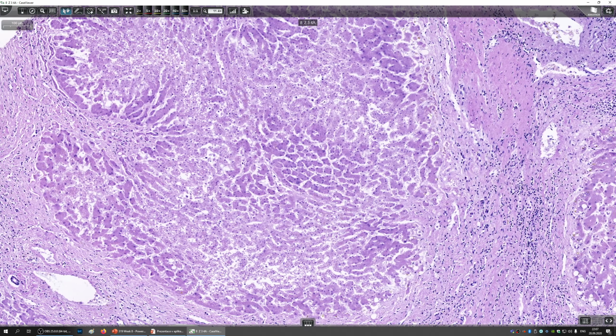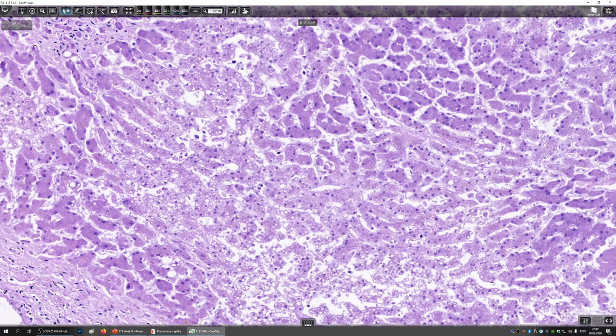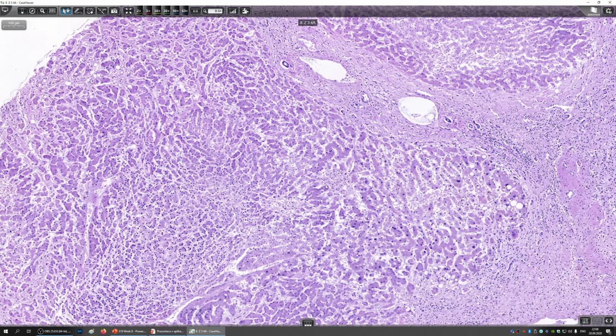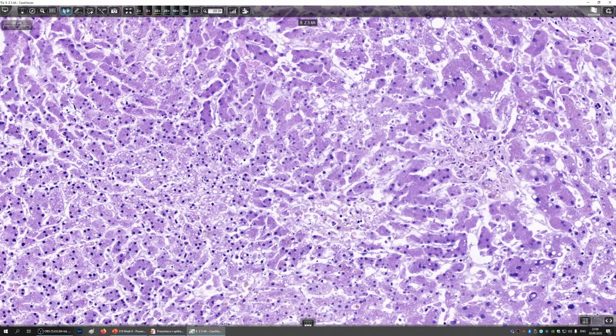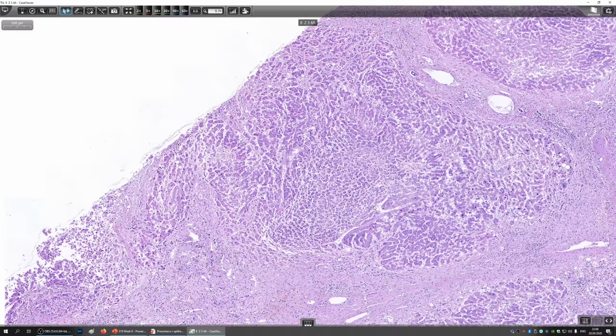So this person had cirrhosis, but we can also see signs that there was very heavy, very serious liver failure before that, because in the middle of the cirrhotic nodules we see very progressed, very serious regressive changes within the hepatocytes. There is vacuolization of their cytoplasm. In some cases you even see like a necrosis beginning, like here the cells are falling apart. So this person had chronic liver failure due to cirrhosis, but it underwent one last flare up before death.